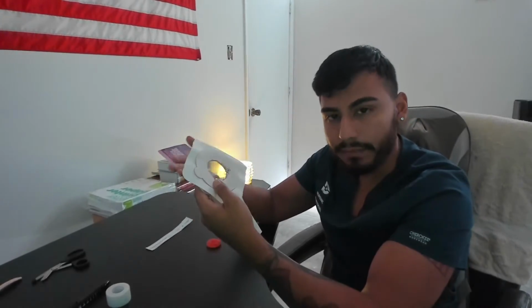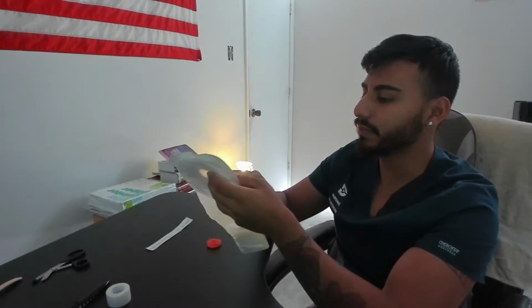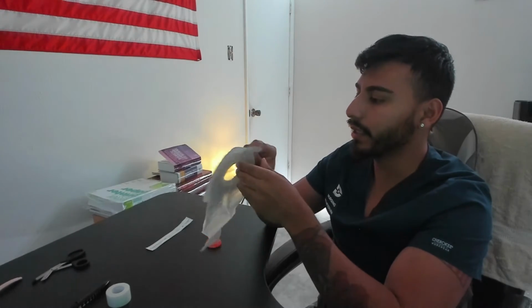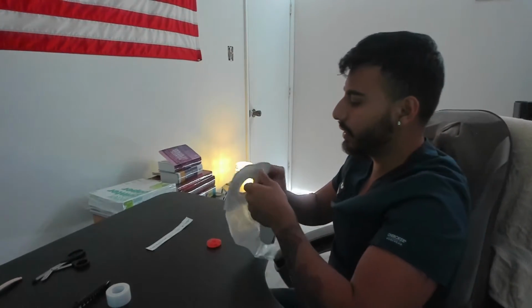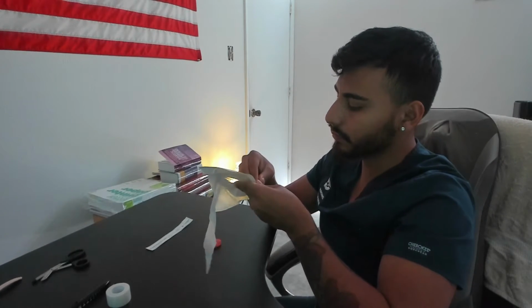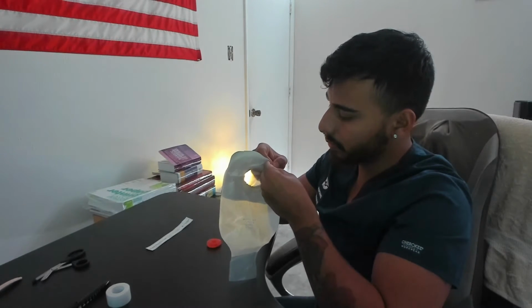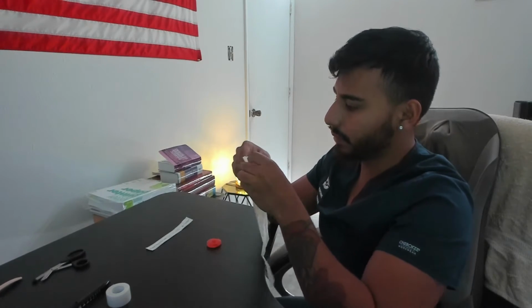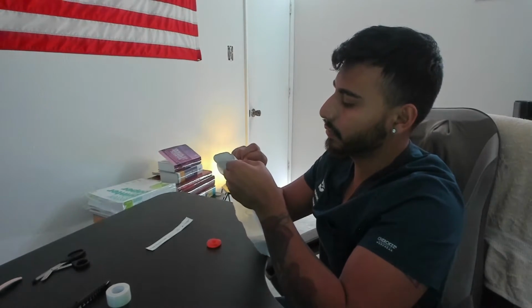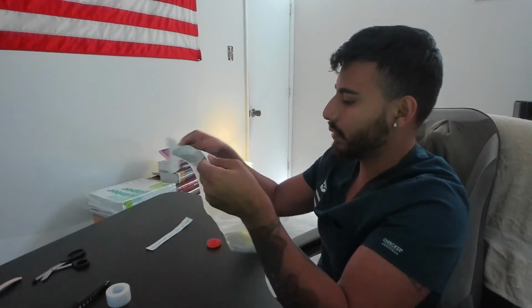I would begin by cutting the wafer and so on, just as I explained it now. So now I'm cutting the wafer. I did everything. Now I can go ahead and peel the sticky part off. Let me see. Okay, there it goes.